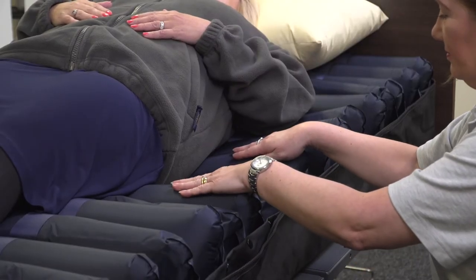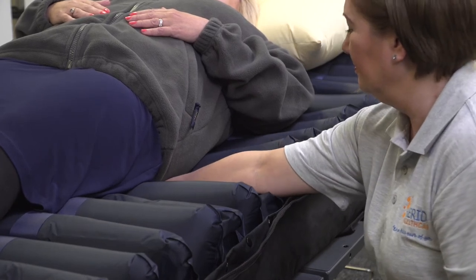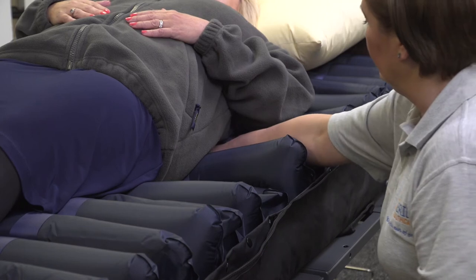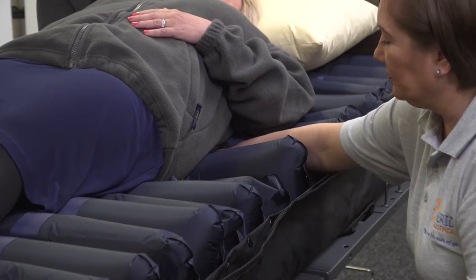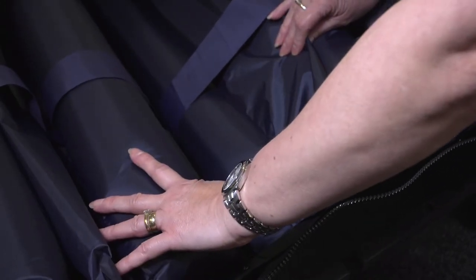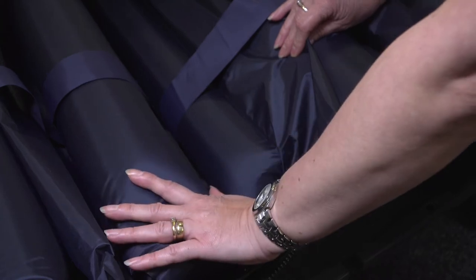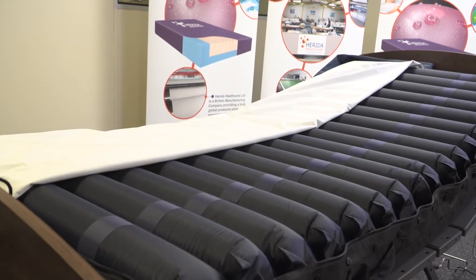The 200mm high cells inflate and deflate in an alternating pattern, providing direct pressure relief throughout the dynamic process. The Herida Argyle II can be used for patients up to a weight of 28 stone or 180kg. The Argyle II is constructed of a layer of 18 200mm deep cells. The product operates in a 1-in-2 cycle and takes 11.5 minutes. Cell construction consists of three static head cells located at the head.